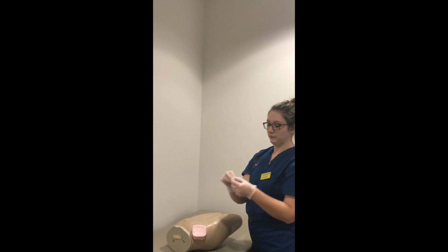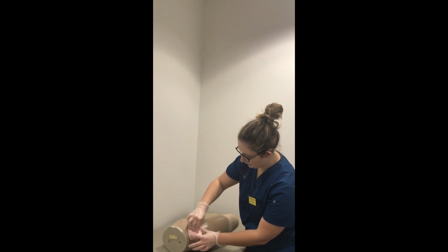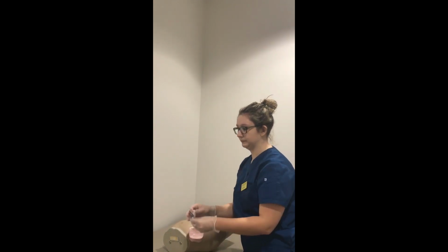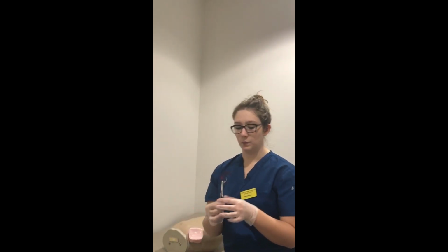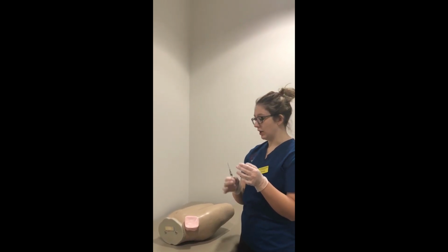Next, I will prep the area with an alcohol swab, starting in the middle and working out, cleaning for about 3 to 5 seconds. I will grab the medication. I will double check that I have the right medication with the label. So I will be giving Haldol. It is 4 milligrams per 2 mLs. I have drawn up 0.5 mLs, and it is going to be the intramuscular injection.